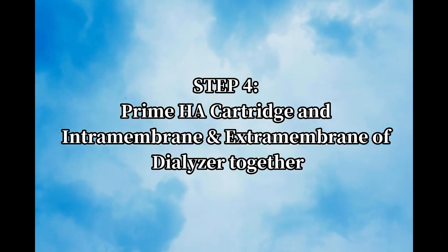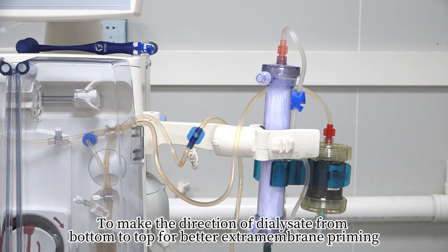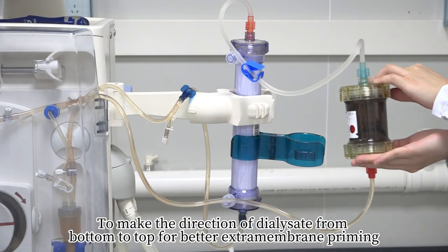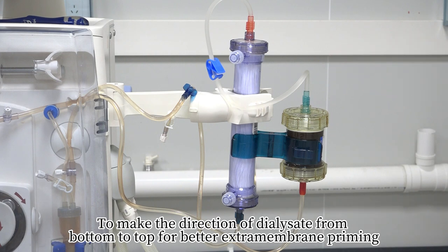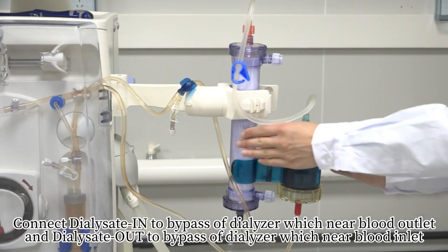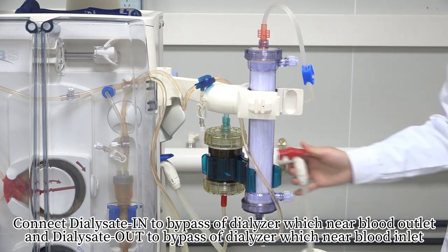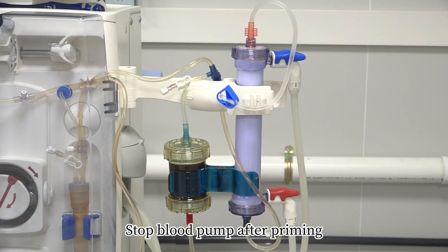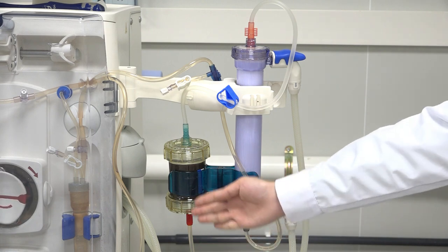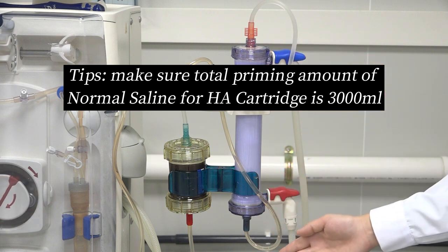Step 4 – Prime HA cartridge and both intramembrane and extramembrane of dialyzer together: Rotate dialyzer 180 degrees so dialysate flows from bottom to top for better extramembrane priming. Connect dialysate inlet to bypass of dialyzer near blood outlet, and dialysate outlet to bypass near blood inlet. Stop blood pump after priming. Tip: Ensure total priming amount of normal saline for HA cartridge is 3000ml.